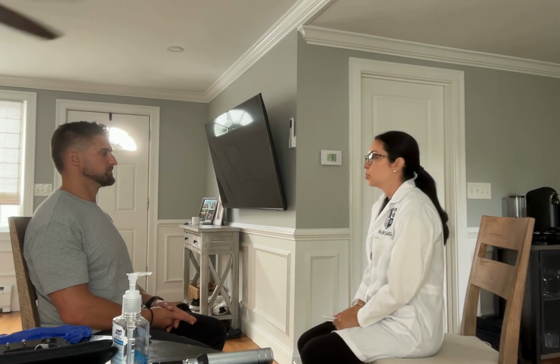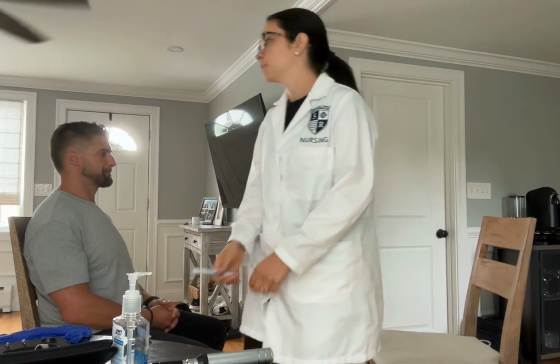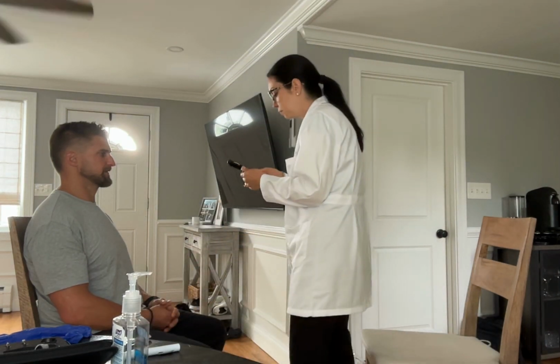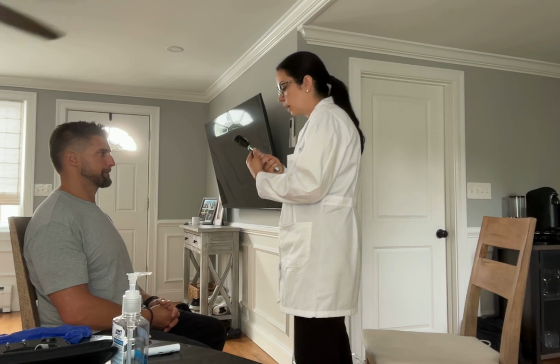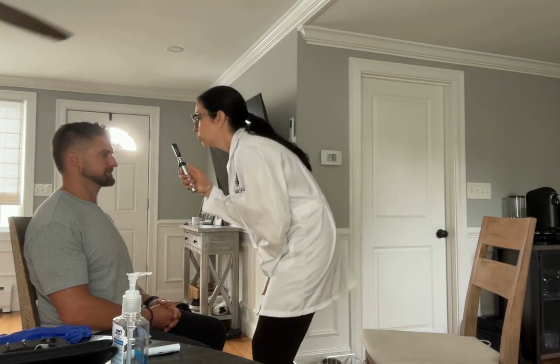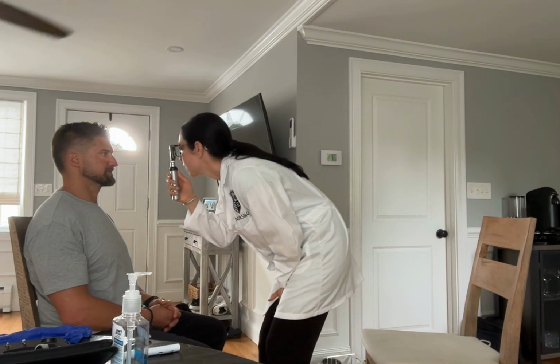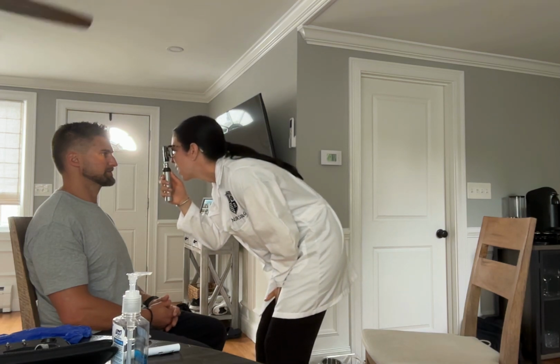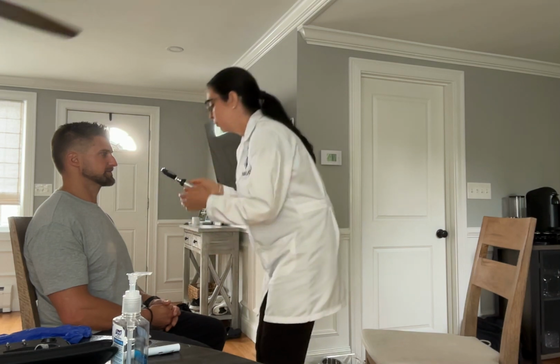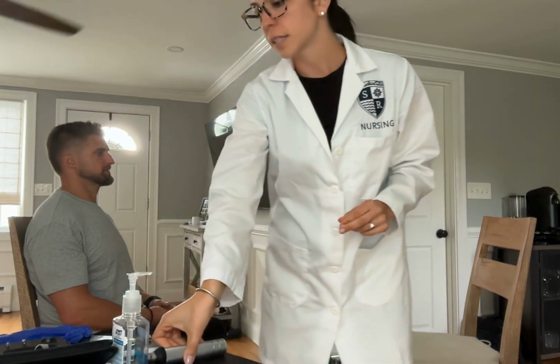Okay, next I'm going to do a fundoscopic exam that looks for the red reflex, the optic disc, the vessels, the macula, and the retina. I'm just going to turn my fundoscope on. You can just look straight ahead. Okay, nice red reflex. His vessels look great. Perfect. Okay, I'm going to close that. That's it for the eyes.